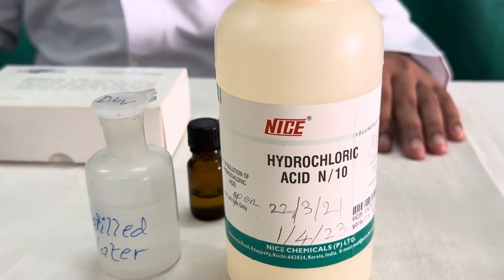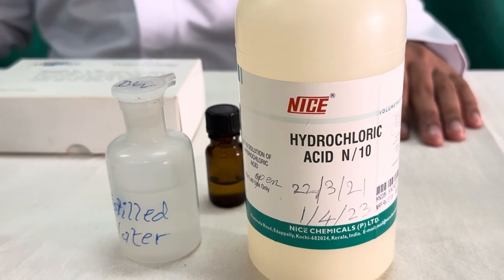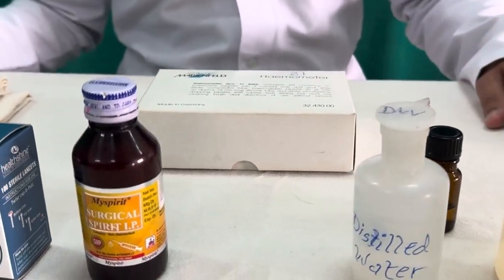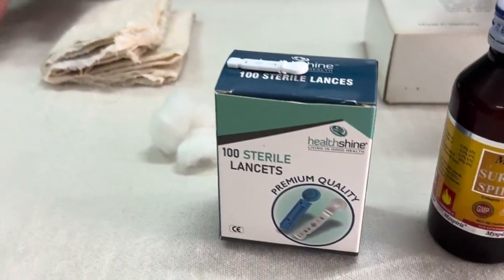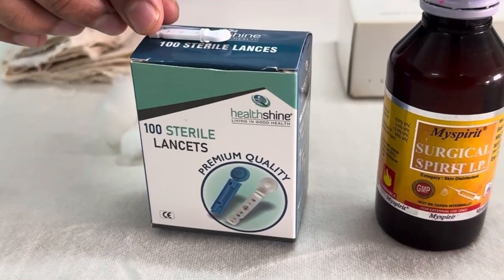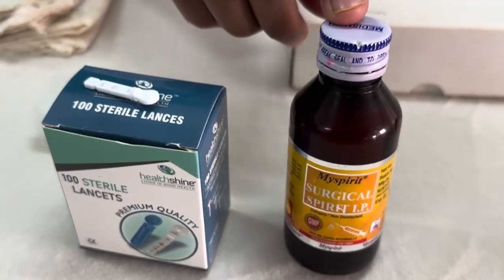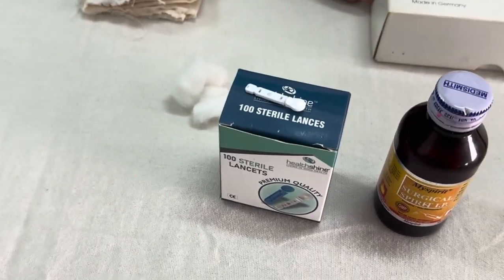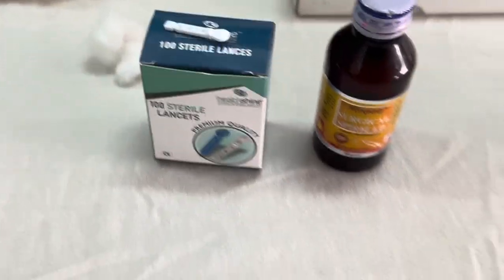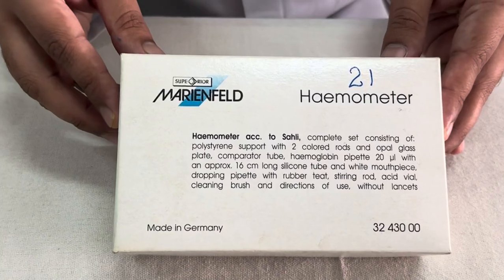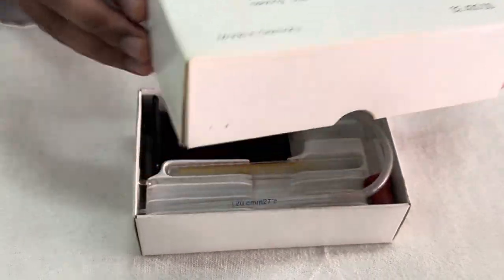First of all we require hydrochloric acid, that is N by 10 hydrochloric acid, distilled water, then instruments like lancets and surgical spirit or gauze or swabs for collection of the blood. Then the most important one is this Saheli's hemometer. Let us see what is there inside this box.